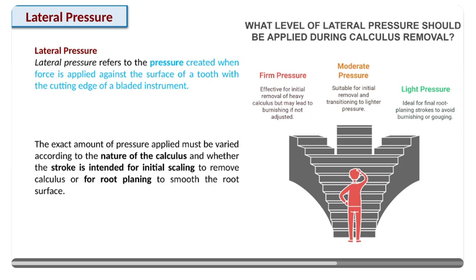It involves applying force with a bladed instrument's cutting edge against a tooth surface. The pressure varies based on calculus type and stroke purpose, whether for initial scaling to remove calculus or root planing to smooth the root surface.